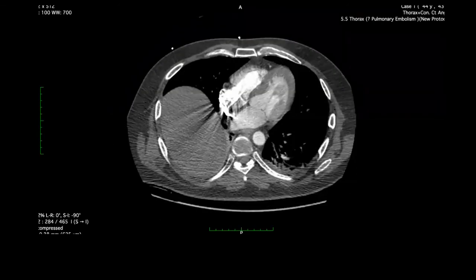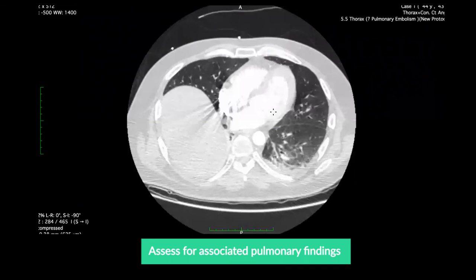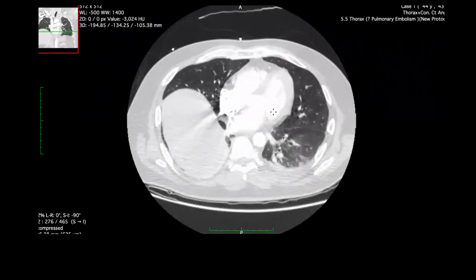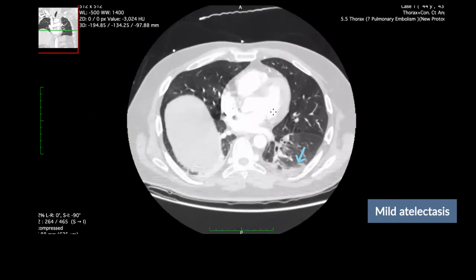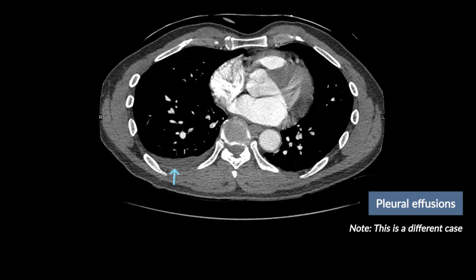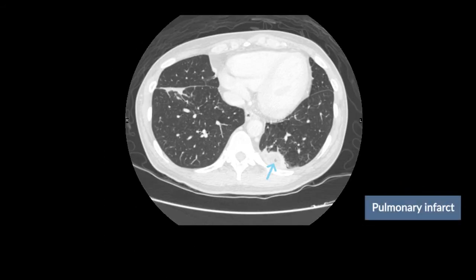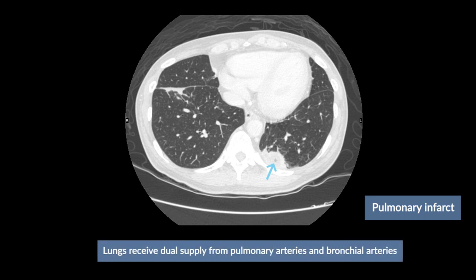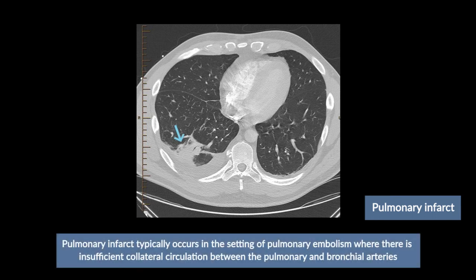The next step is to change the window to lung windows and assess for associated pulmonary findings. In many cases the lungs may be normal, or simply mild atelectasis in the area supplied can be seen. Pleural effusions are also possible. Pulmonary infarct is not common as the lungs are supplied by both the pulmonary arteries and the bronchial arteries with rich anastomosis. However, in cases of insufficient collateral circulation, pulmonary infarct can occur.